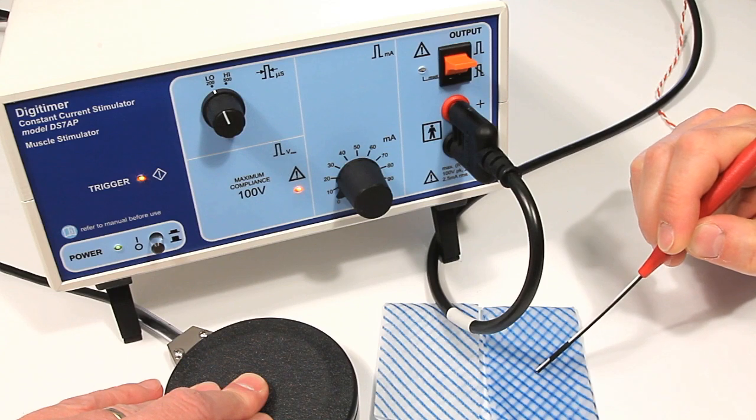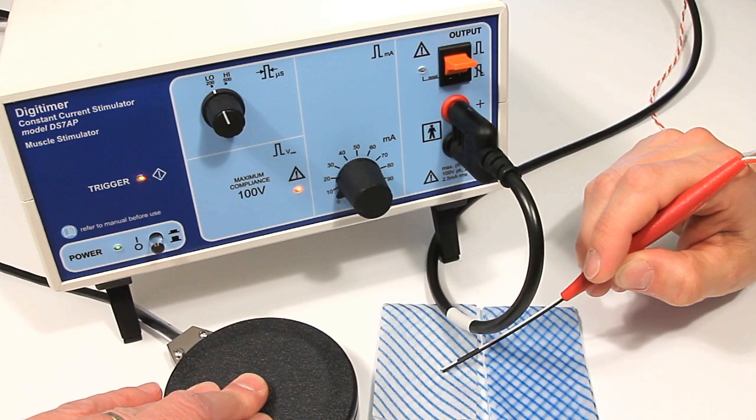For testing purposes, stimulation can be simulated with a saline soaked paper towel.